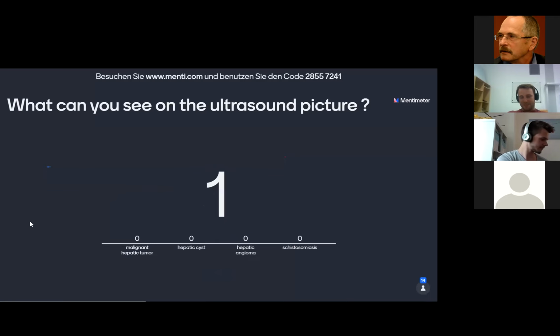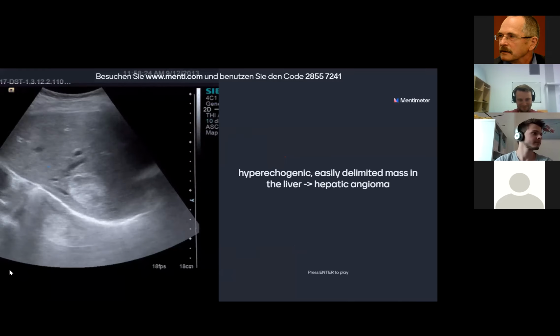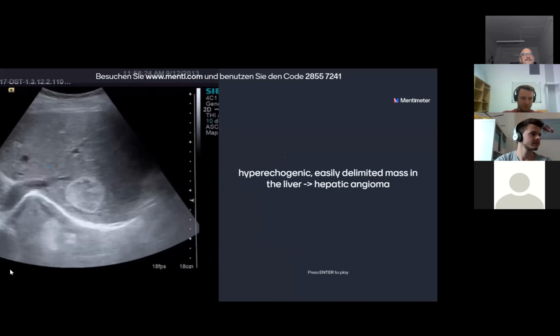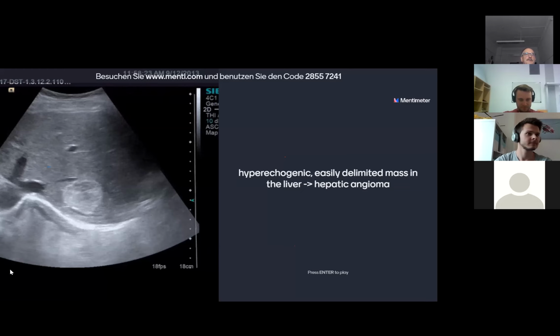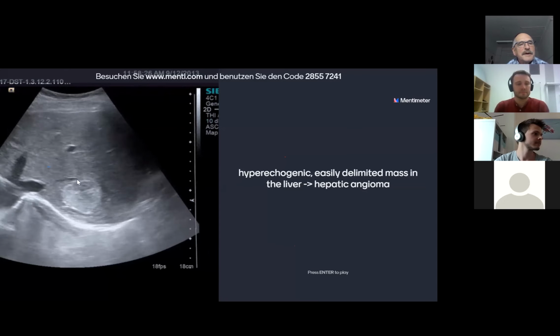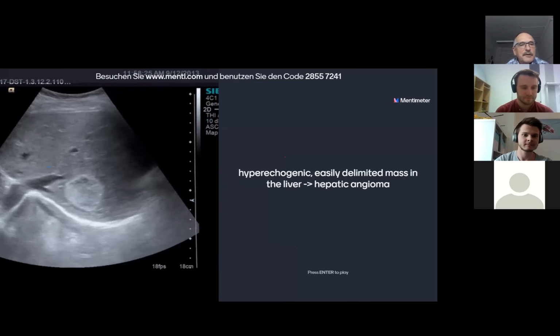So 3, 2, 1. Let's see. I think there is a high chance everyone is right. For the beginners, Professor Neumann, would you like to elaborate a little bit? You see a sharply bordered, echo-rich lesion, and you have no symptoms, a young boy, asymptomatic. In some areas it's a little bit inhomogeneous. Perhaps it's not a capillary, it's a cavernous hemangioma.